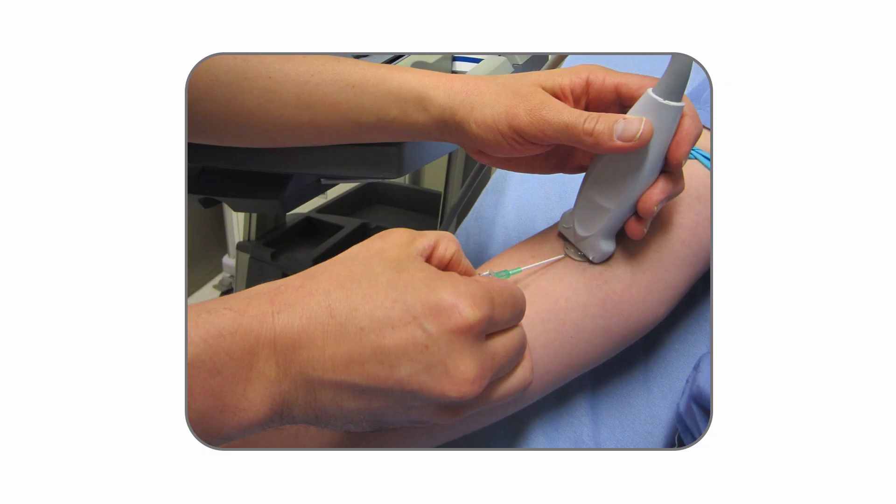When I was in residency training in emergency medicine, patients in whom I couldn't get an IV ended up getting central lines. This was a long time ago. Then ultrasound machines started becoming more available and I started using the ultrasound to find deep veins in the arms, and that really decreased the number of central lines I was placing.